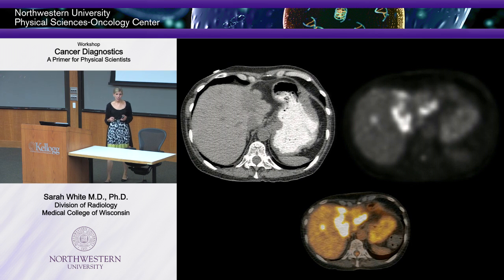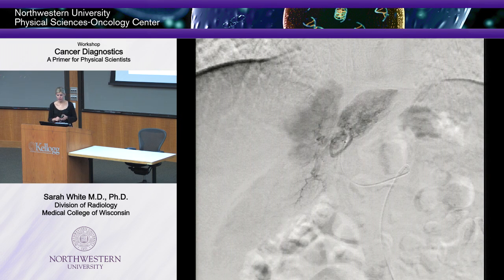Do I try chemoembolization on her? Do I go up in there and treat her with chemoembolization? Well, I sure could, but there's something that might be a little bit better, okay? There's something called Y90, or radioembolization. So we went in and we did an angiogram, okay? And this is what her left hepatic lobe looks like. So the left part of her liver.